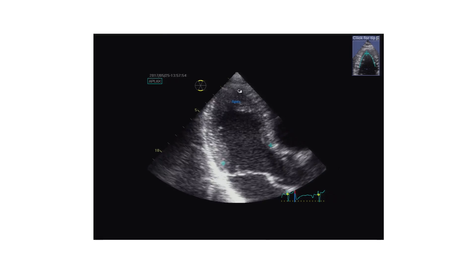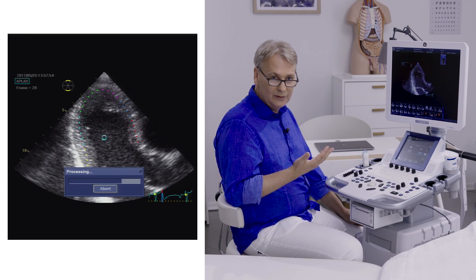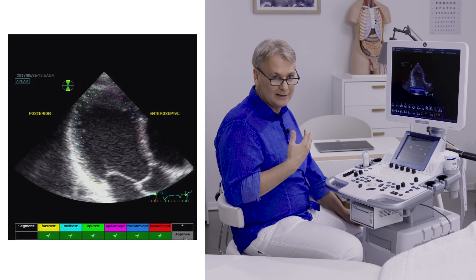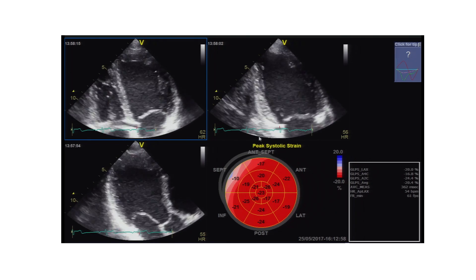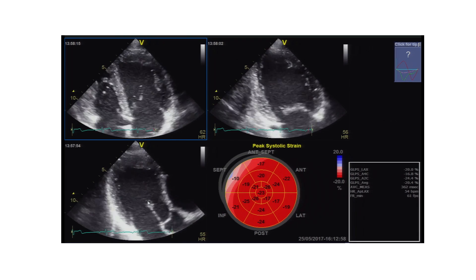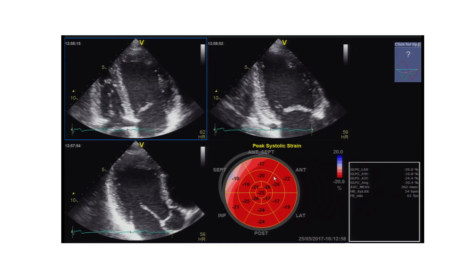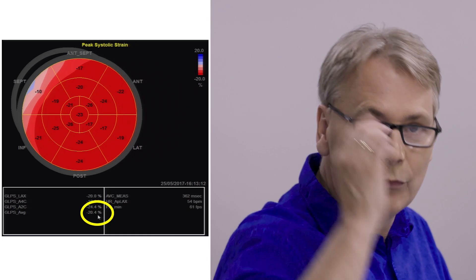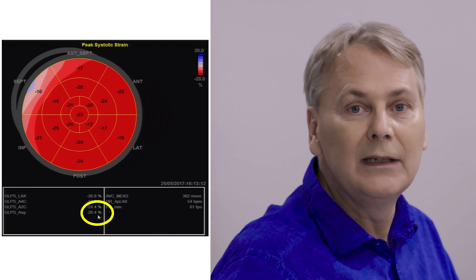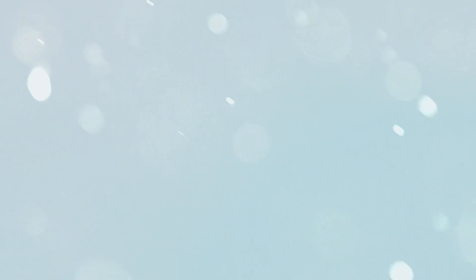The contour was found quite nicely. If you're not happy, you can reanalyze it. We have all three apical views that we were using. We've got the bullseye display. We have minus 20.4%, which denotes a completely normal longitudinal strain.